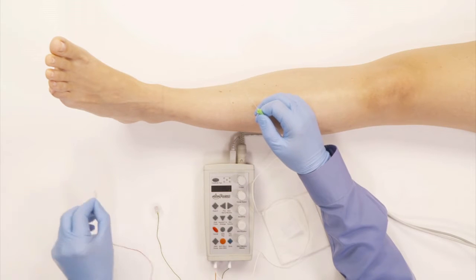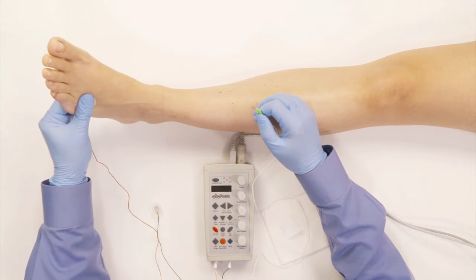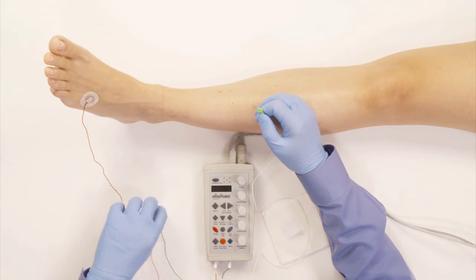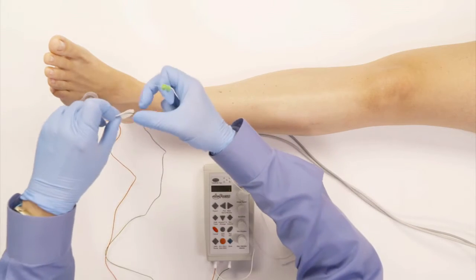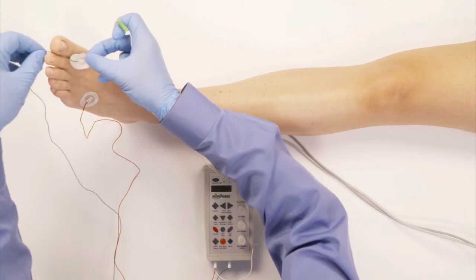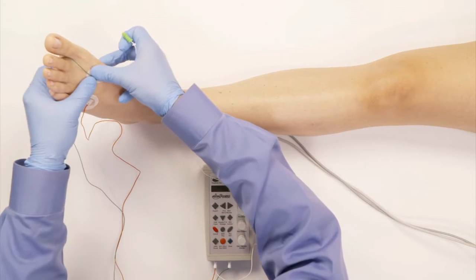Before I do that, of course, I'm going to put the reference electrode right here, and then I'm going to put the ground electrode right here. Be careful not to stick yourself with the needle when you're doing all of this.